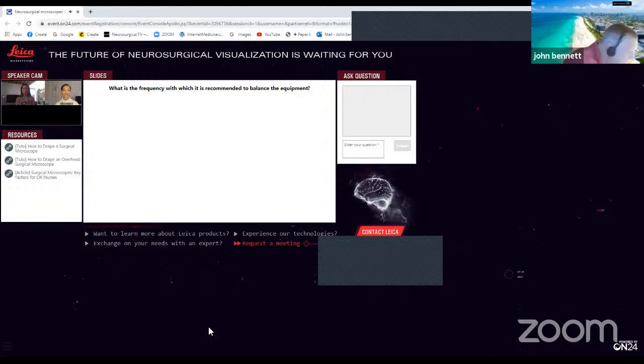Well, thanks a lot. So next, our audience would like to know, is it necessary to use Leica sterile drapes for your microscopes? No, not at all. You can use drapes from different brands. Just have a look in your region at what kind of drapes are compatible with our microscopes or with the microscope you are using. If you need any help, please contact the Leica representative for your region, and for sure you will be assisted on that.